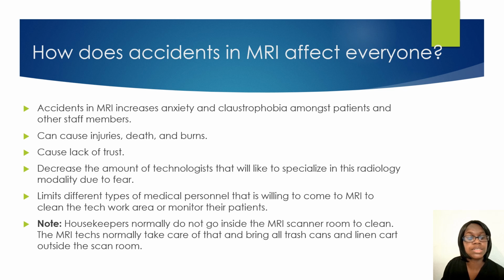So you just want to make sure that anyone who is entering inside the MRI area knows everything they need to know about MRI and safety and how far they can go inside of the MRI suite. Maybe they can go inside the MRI tech area but cannot go inside of the MRI room. I know a lot of places the housekeepers cannot go inside of the MRI scanner room. The techs normally go in, they'll take the trash cans out, place them on the outside of the door for the housekeepers, or they may even have like a little mop where they go in and do a clean themselves of the MRI room.